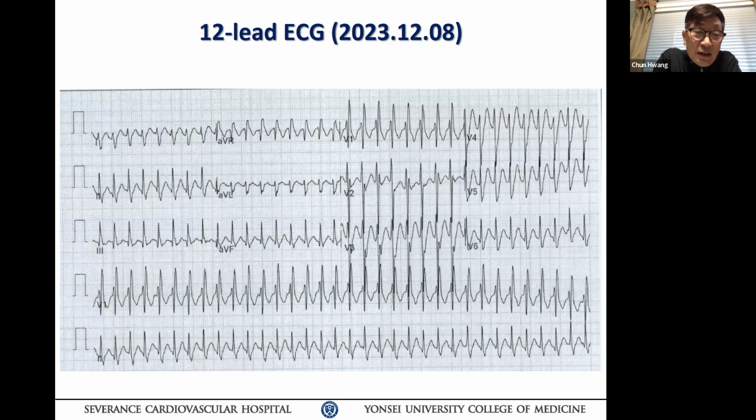So who favors VT? How many of you are in there right now? I see one, two, three, four, five, six, seven, eight, nine of you in the room, right? So don't you always vote for this? Who favors SVT?